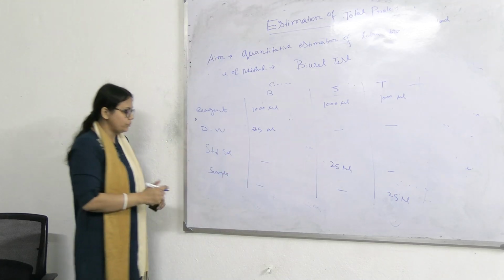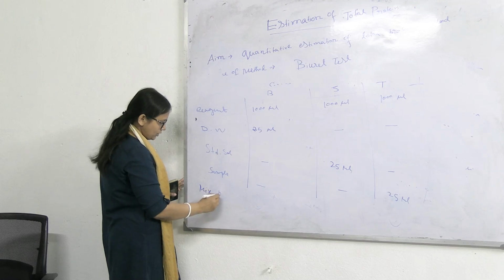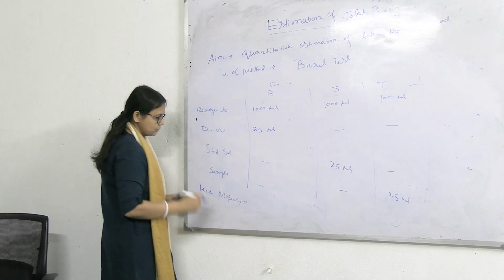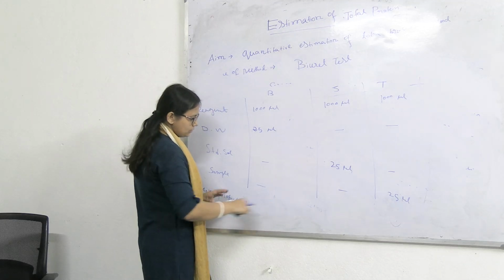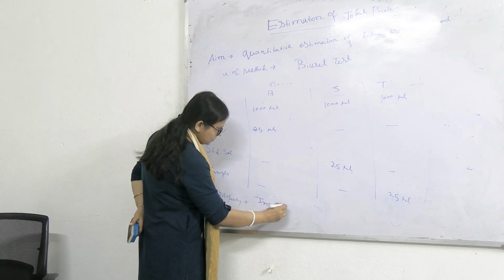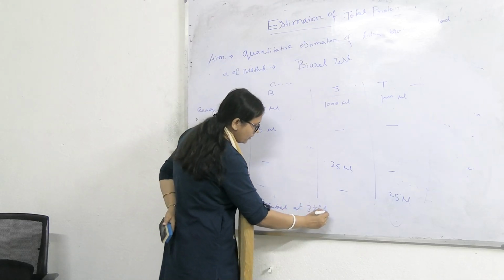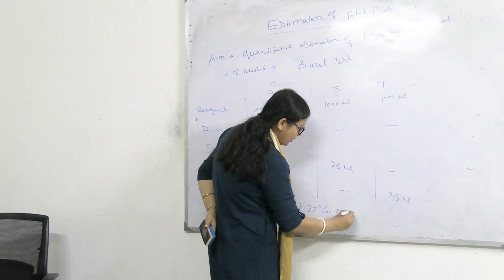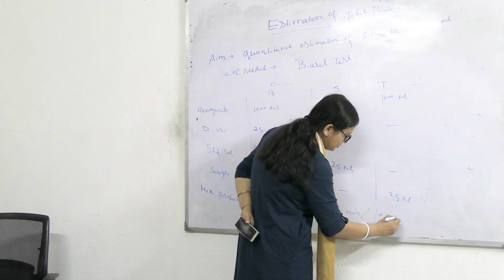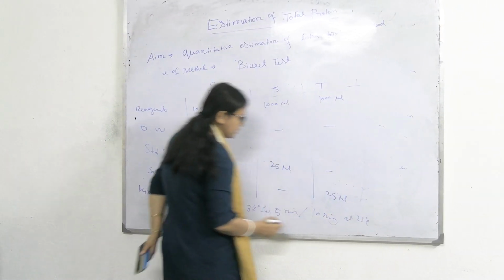Then we have to mix properly and incubate at 37 degrees Celsius for 5 minutes, or at 25 degrees Celsius for 10 minutes.